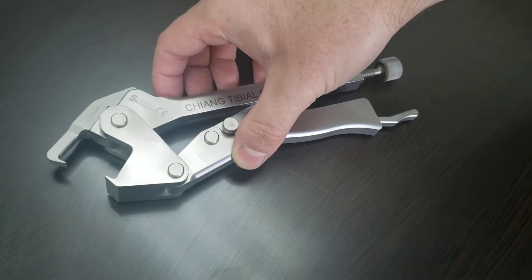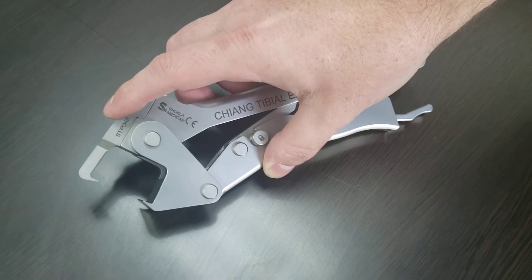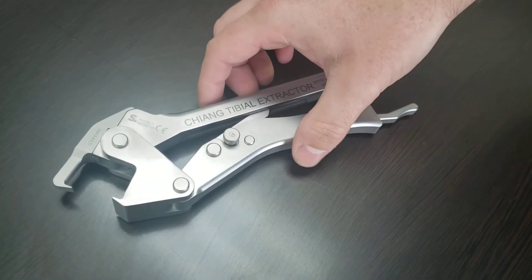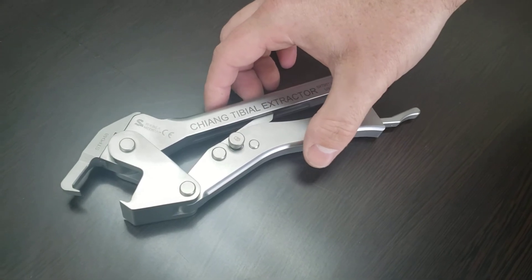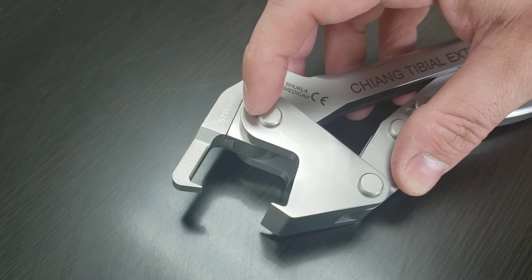This new tibial extractor design has a modular posterior jaw. What that means is that the jaw can be removed if it breaks and replaced with a new one, instead of replacing the entire extractor. Since the body and jaws are separate parts, they mate with each other by sliding the jaw into the slot on the body.